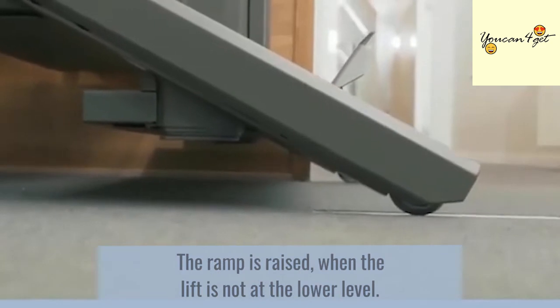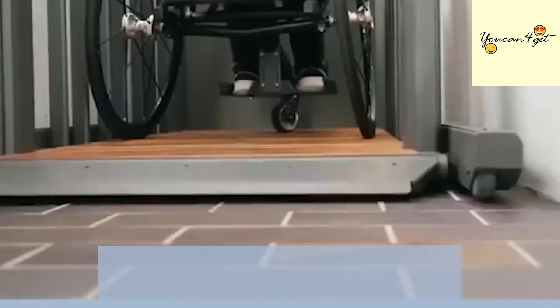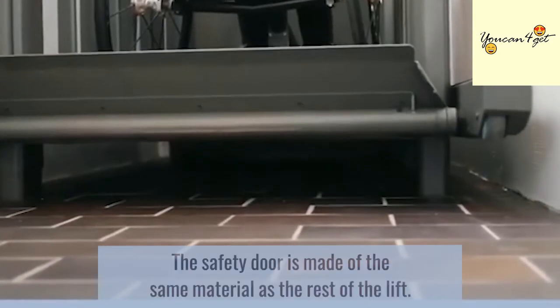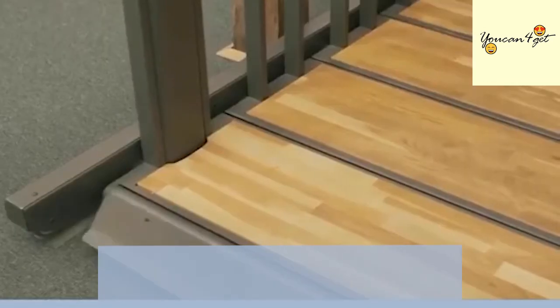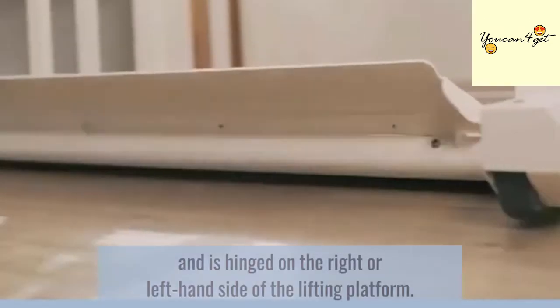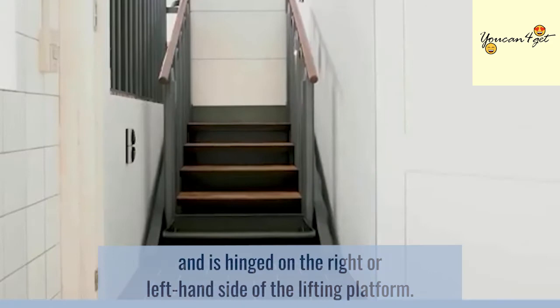The ramp is raised when the lift is not at the lower level. The safety door is made of the same material as the rest of the lift. It's fitted with either a clear or smoke polycarbonate plate and is hinged on the right or left-hand side of the lifting platform.